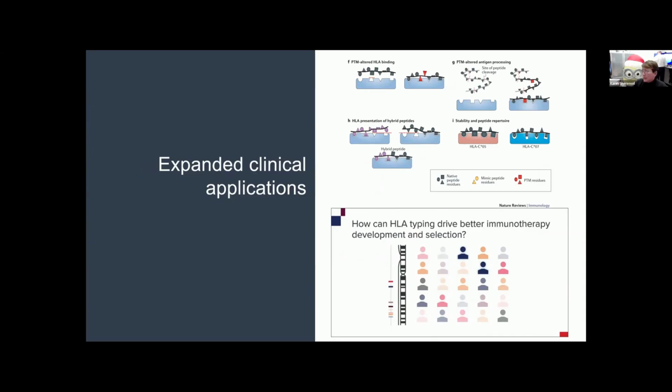There are also some expanded clinical applications outside of just HLA transplantation. Beyond transplantation, sequencing-based HLA genotyping also could underpin individualized cancer vaccine design, autoimmune disease association studies, and, as I mentioned before, pharmacogenomics, where allele level resolution is critical for predicting adverse drug reactions. And by implementing long read sequencing in our clinical program, we can begin to provide single comprehensive HLA tests that can be requeried over a patient's lifetime for emerging HLA associations and expanding precision medicine applications in our routine care.